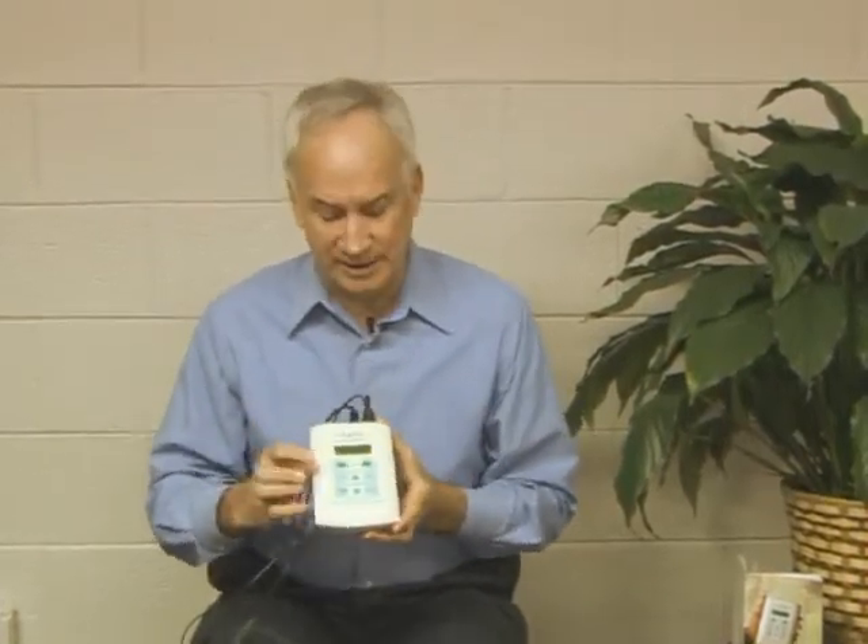Now if you can't do that — you're traveling, going somewhere, or getting ready to start some type of activity that causes you pain — you can remove this and use the batteries. That's another way to use the unit. It is portable, and you can still use it on interferential that way.